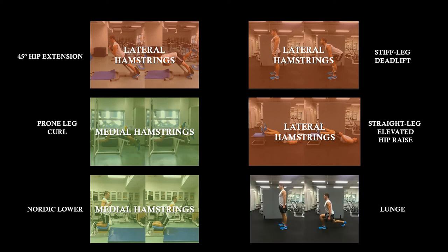If you can just about make out the chap in the bottom right, he's flexed his knee and flexed his hip, which means that the muscle is lengthened at the hip, so we're stretching the muscle at the hip, but it's been shortened at the knee. So because of this, the hamstring length stays relatively unchanged throughout this motion. Therefore, there is no preferential recruitment in either side of the hamstrings, lateral or medial.